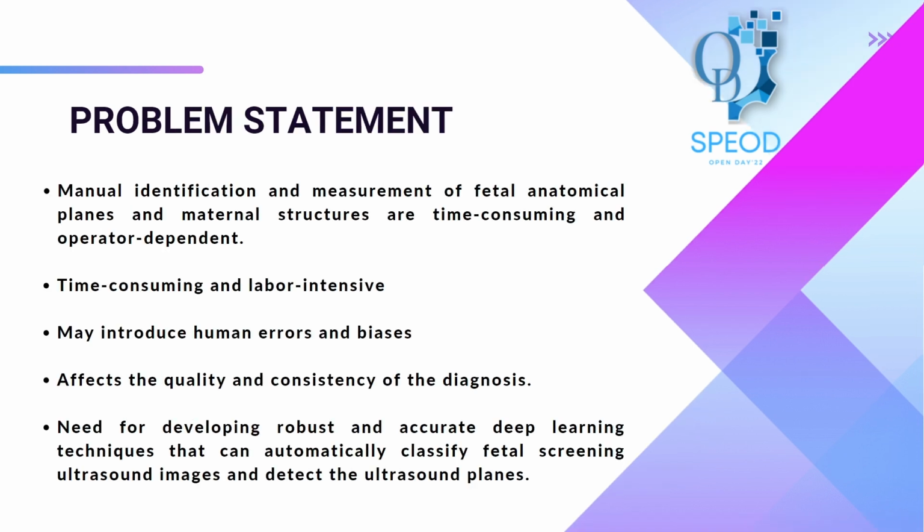So the problem statement is that whenever we do manual measurements of fetal anatomical planes and maternal structures, they are time consuming and labor intensive, and they can have human errors and biases. So basically what we are trying to do is develop a deep learning model that can do all that effectively.